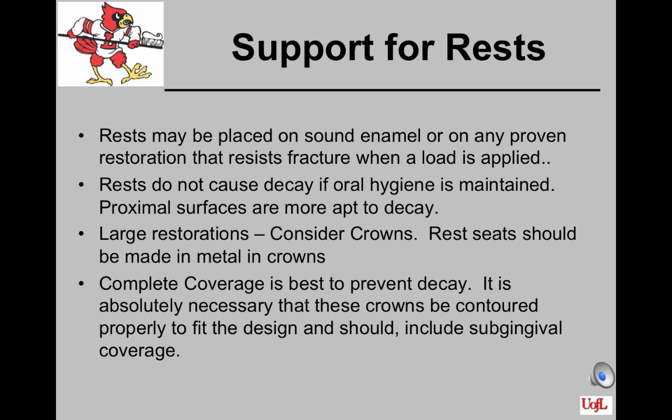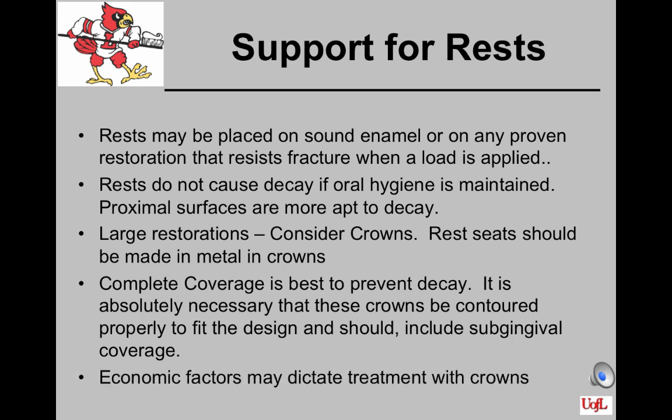It's absolutely necessary that these crowns be contoured properly to fit the design of the partial denture, and it should also include subgingival coverage with the crown. Economic factors, though, often dictate whether a patient can or cannot have a tooth crowned, unfortunately.